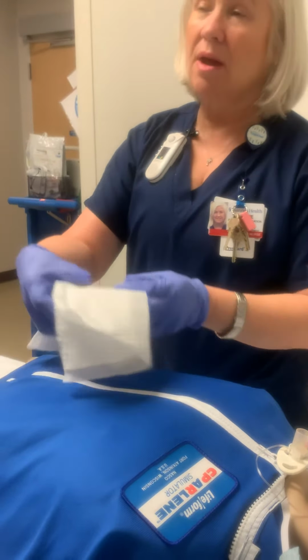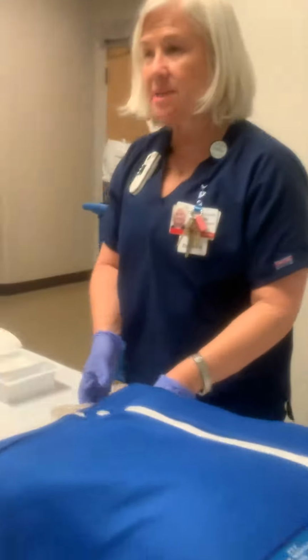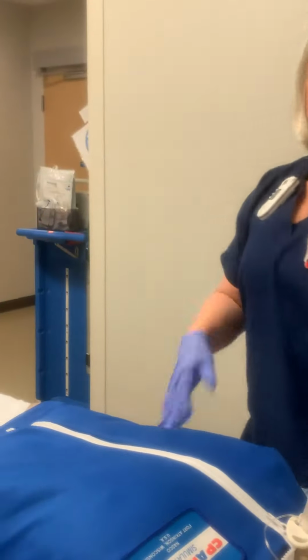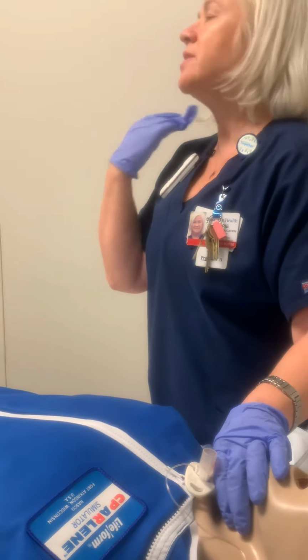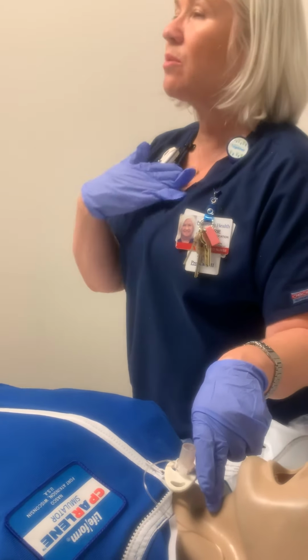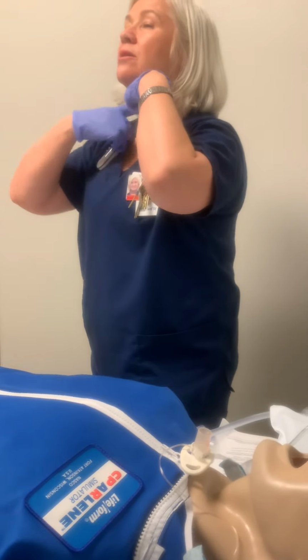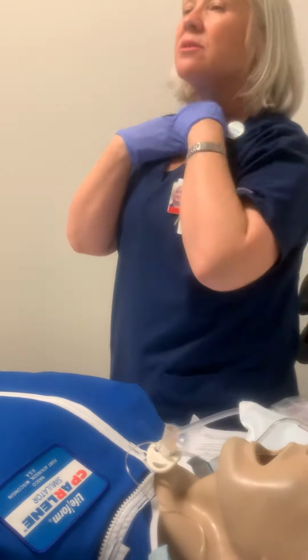Well, it depends where they are along in getting their trachs out, etc. And if they also want to talk, they have talking trachs. So they have many different types of trachs, fenestrated trachs. You have tons. It depends what they're wanting to use it for. So they'll cap them so they can talk. Because remember, your trachea is here, your larynx is here. So the air's coming out here. You can't talk because nothing's vibrating the vocal cords. So they'll cap it so they can talk.